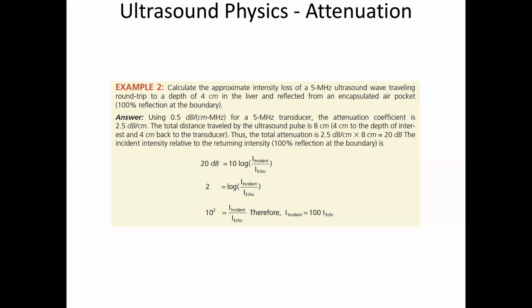And so if that's below the amplitude your receiver can detect above, say, baseline noise, remember the Rose criterion and all that, so we need that signal to be sort of 5 times the background noise or whatever. If that's not happening, then what do we do?